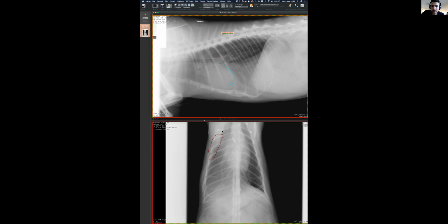If that is the case, usually, unless you are in the border of two lung lobes, and we call that a lobar sign, the disease within the lung has ill-defined contours. Makes sense? So it would be extremely unusual for a disease within the lung to have this contour. It would be extremely unusual for this part of the lung to be affected and then to have a very sharp delineation to the unaffected lung.